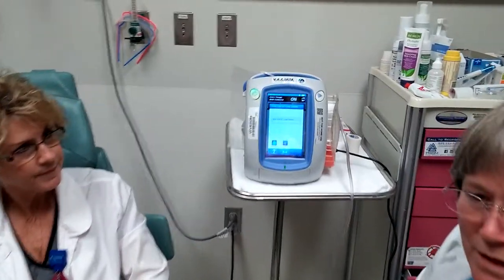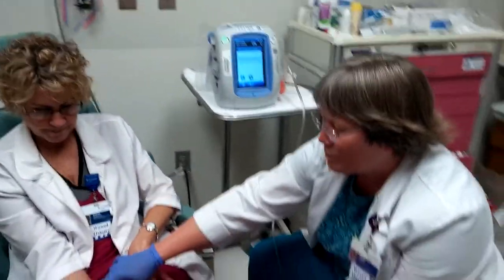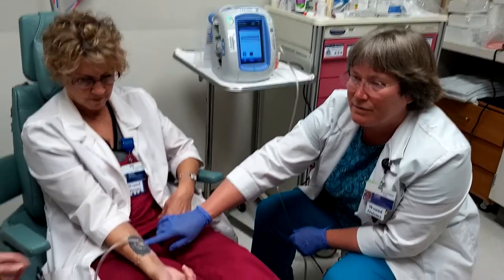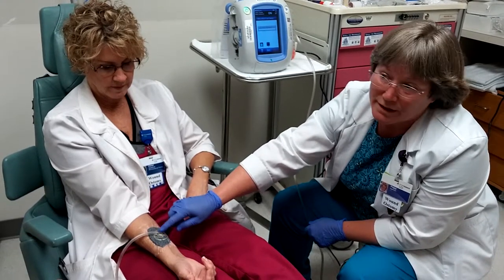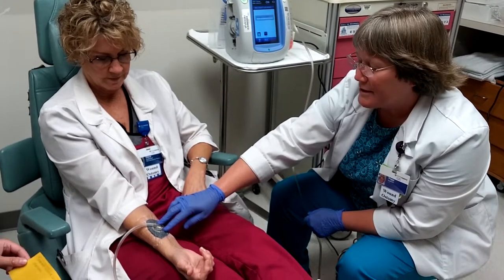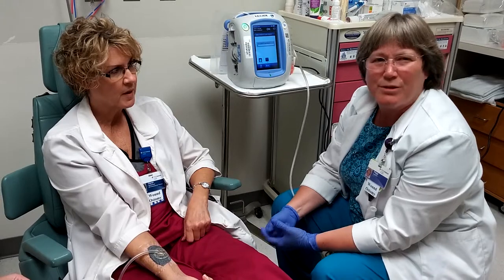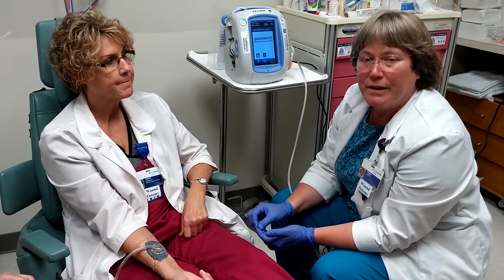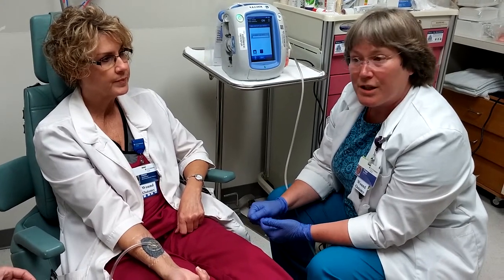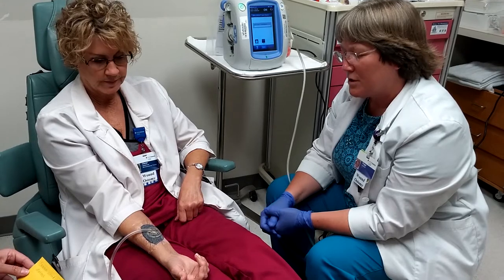How about some common wound vac alarms? One of the common ones is blockage. If it alarms blockage, you'll want to look and see if there's some bleeding under the dressing for some reason. It could be blocked if there wasn't a large enough hole cut under the track pad. You'll want to give one of us a call on the wound team, or if you don't see us on the chart, sometimes some of the ortho or vascular docs have been doing their own dressing changes — give them a call, because some of them don't want the dressing taken down, so double check.